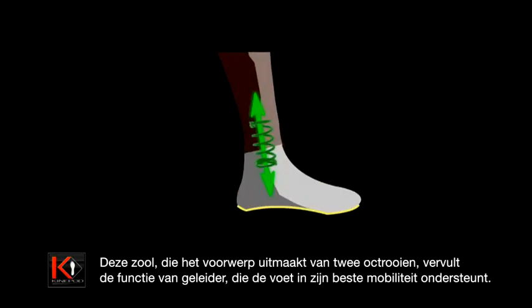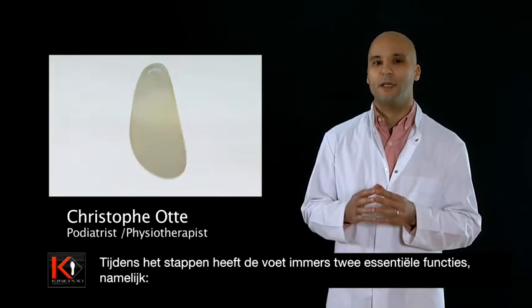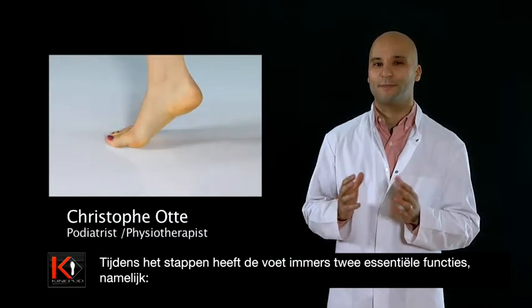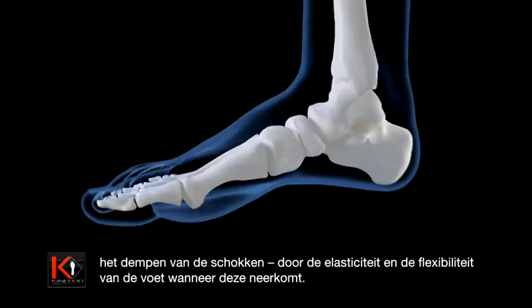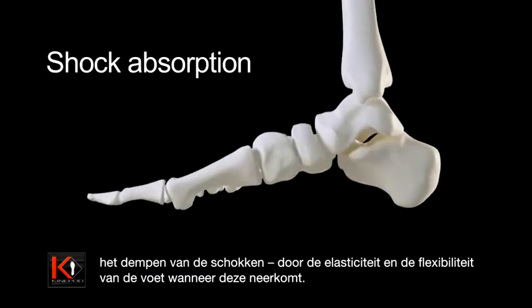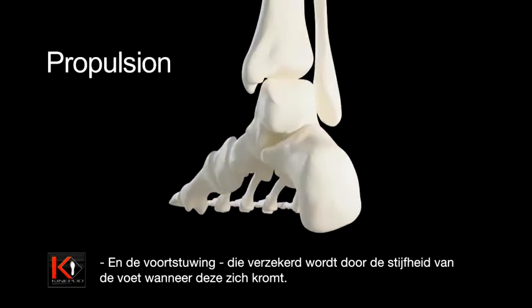Covered by two patents, the function of this sole is to guide the foot into better mobility. While walking, the foot must be able to carry out two essential functions: absorbing shocks, done by the elasticity and flexibility of the foot as it presses down, and propulsion, done by the rigidity of the foot as it pushes up.